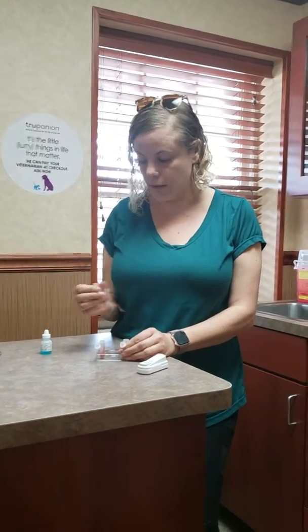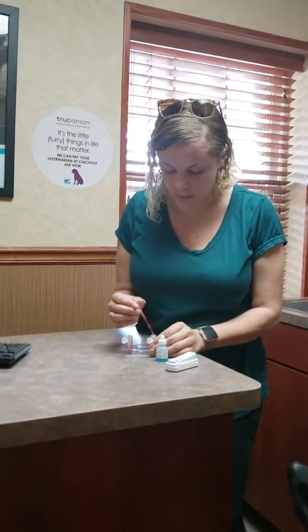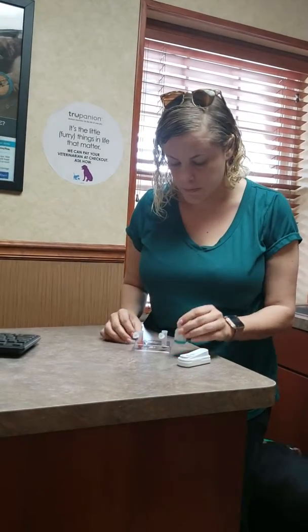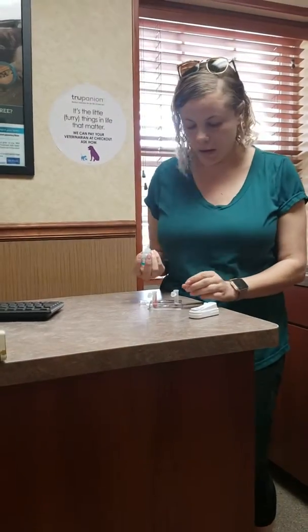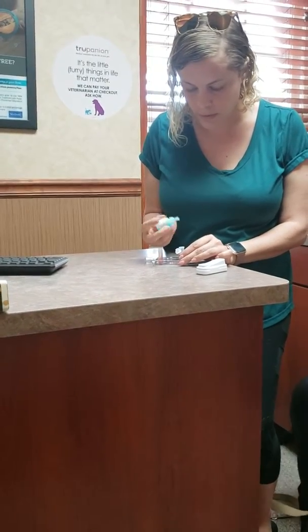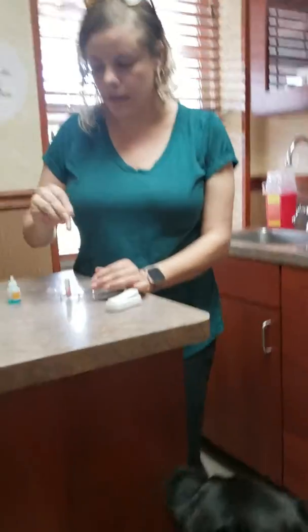I'm going to put three drops of blood in here with four drops of the conjugate. I put one drop already, so I'm going to put... I need another pipette. Three, four. And then I'm going to mix them together.